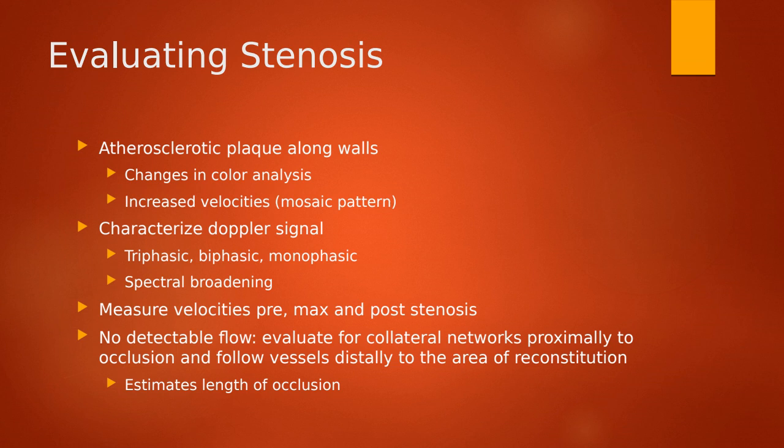So plaque typically will jump out at us, especially if it's focal plaque, but sometimes we can have patients who have diffuse atherosclerosis, and that makes our job harder because the plaque is small. It kind of layers along the walls of the arteries, and it makes the vessel itself blend into the surrounding soft tissue. So we actually can't even really see the vessel. So plaque is really not our friend, especially in the legs.